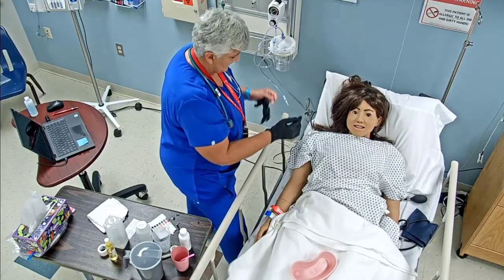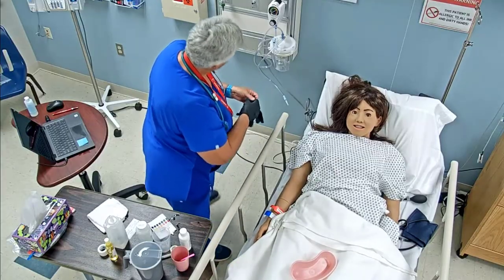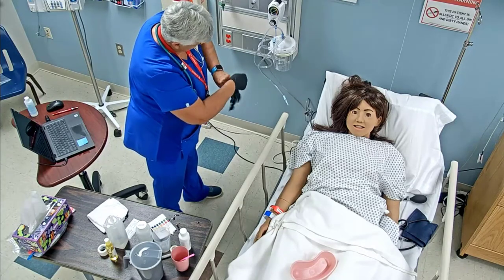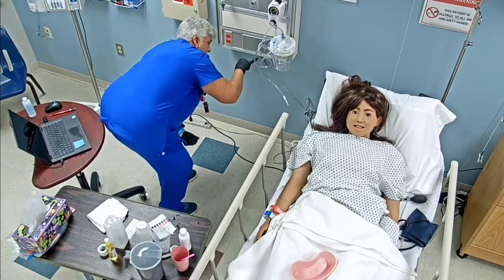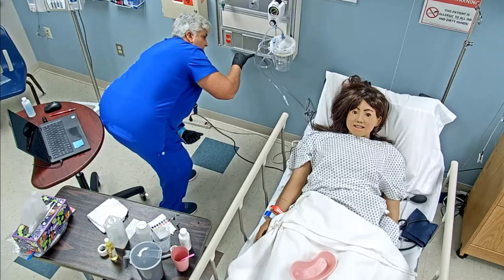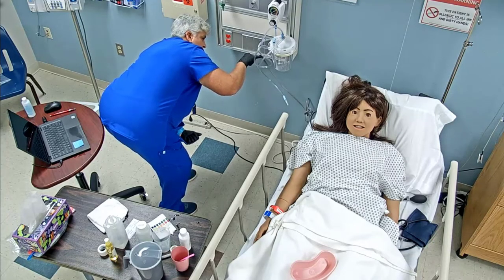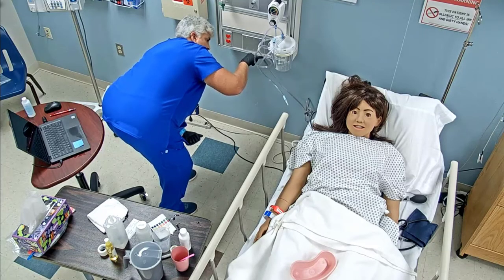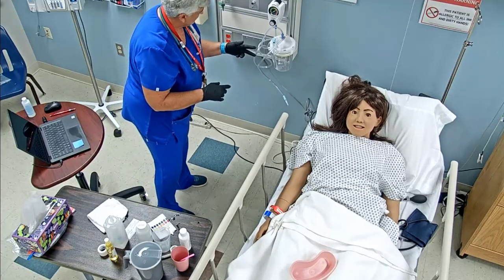Call light within reach, making sure the wheels are locked. And now I'm going to go over here and I'm just going to be assessing the drainage, okay? I'm going to be measuring, get down eye level. With each shift we were measuring, and so I would deduct from the last line to today, so I knew exactly how much, so I can document I's and O's.